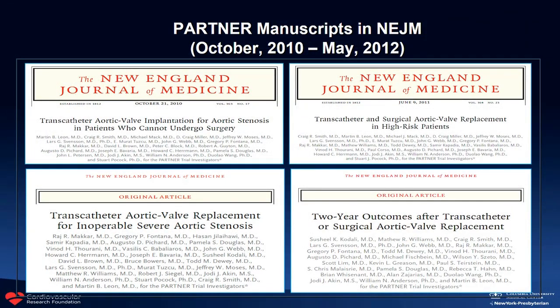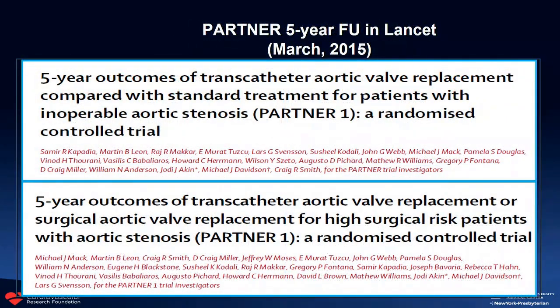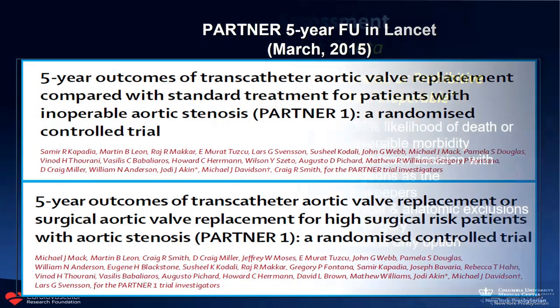We actually have, as I said, studies across all the risk levels: extreme, high, intermediate, and low risk. All those trials have been published in the New England Journal of Medicine. All of them have been randomized clinical trials. So we have really very supportive data on the 1-year results. But we also have 5-year outcomes from PARTNER 1, which was the first study. And we have also studies now going all the way up to 10 years follow-up, although most of those patients, because of their age, didn't last that long.